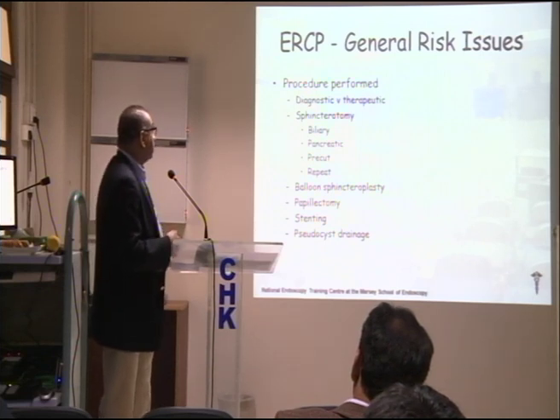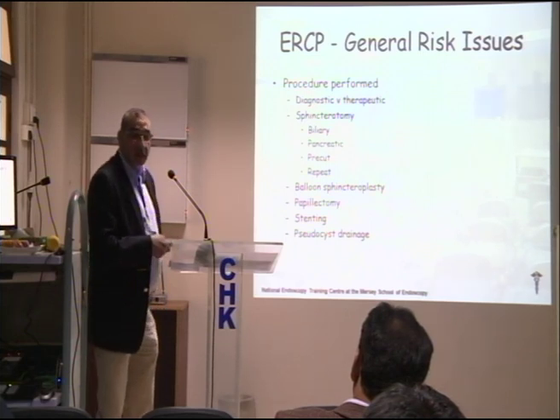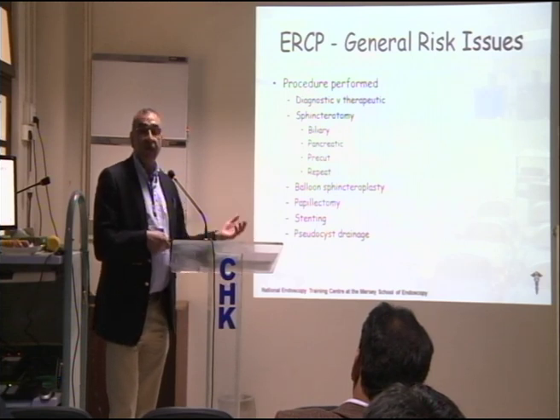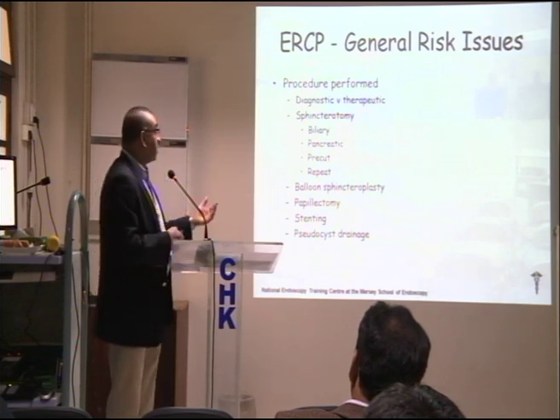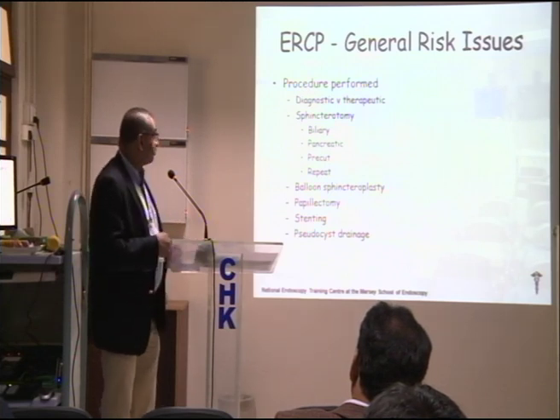Whenever you do anything and carry out treatment, your risk of complication goes up. If you carry out a diagnostic colonoscopy, your risk of perforation is close to 0. If you carry out a therapeutic colonoscopy involving large polypectomies or flat adenoma resection, your risk increases exponentially. Similarly, in ERCP, the higher the risk procedure that you perform, the higher the risk of complication.